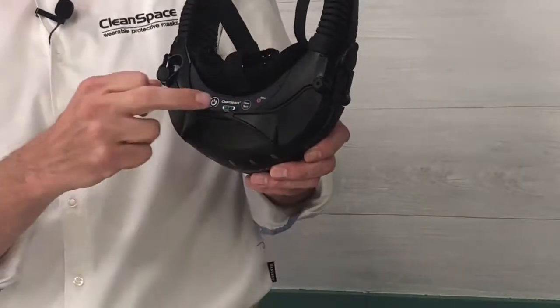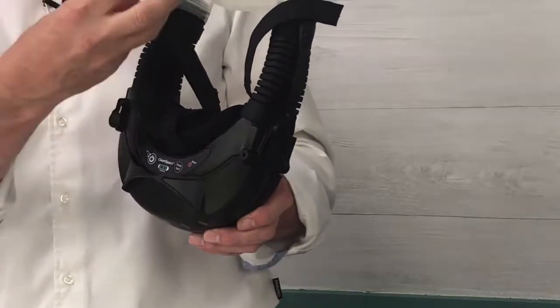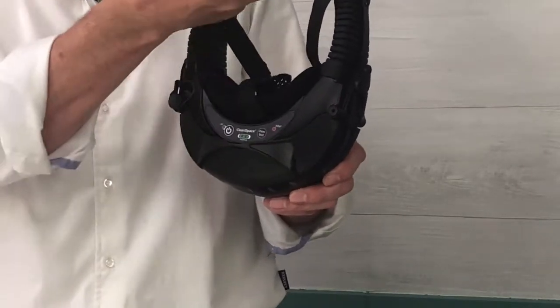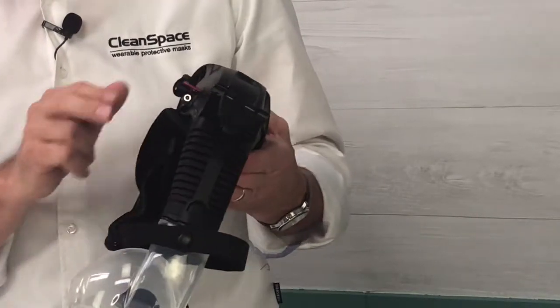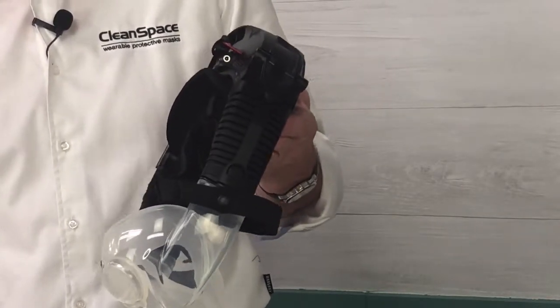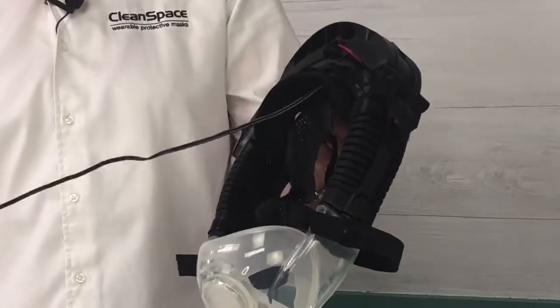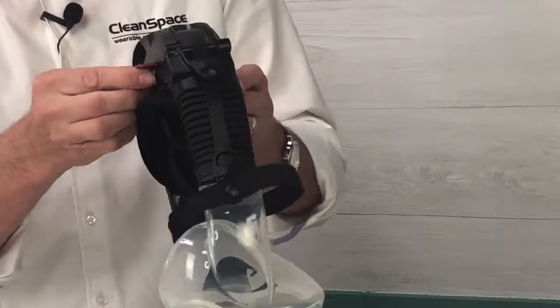Now you may notice that the green battery indicator lights have gone off. That's because I haven't actually put the mask on yet. I haven't activated the motor. The product will stay in standby mode for 3 minutes. So on the bottom of the device we have the recharge port. This is a DC jack system. Recharging CleanSpace is very similar to charging your mobile phone. The jack is put into the port, and then the block is put into the power supply. So it's a very simple recharge system.